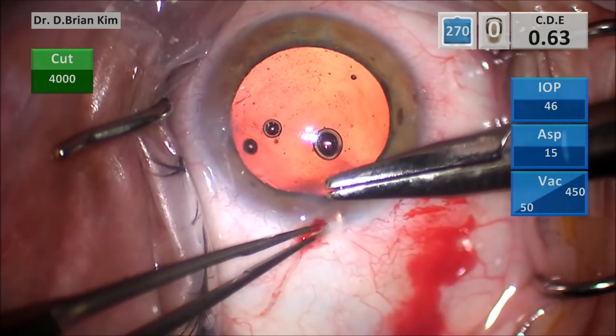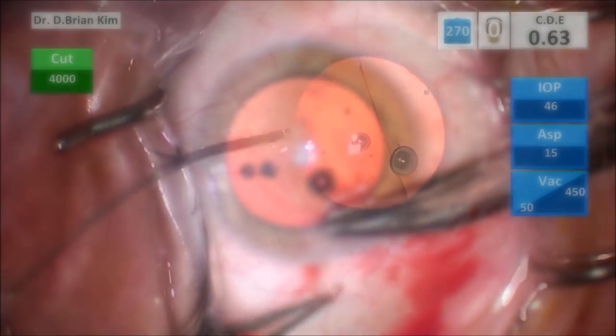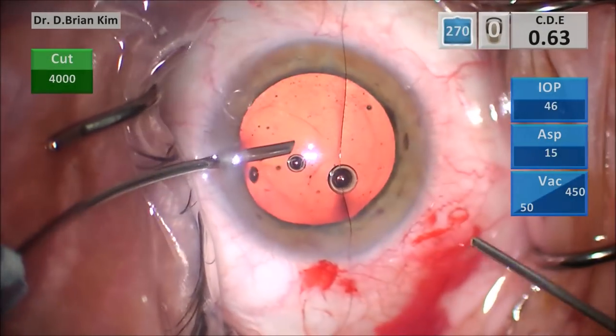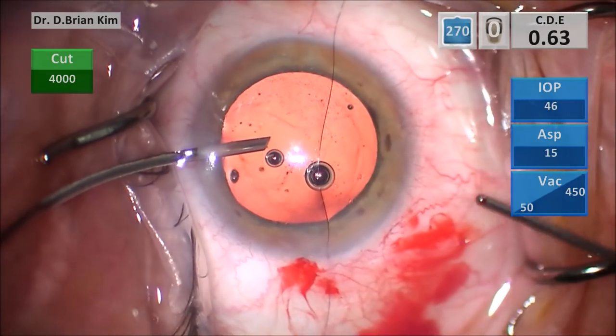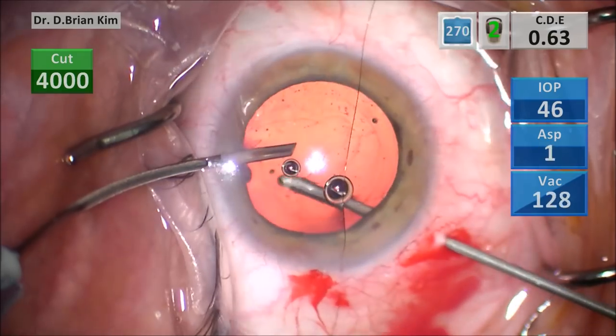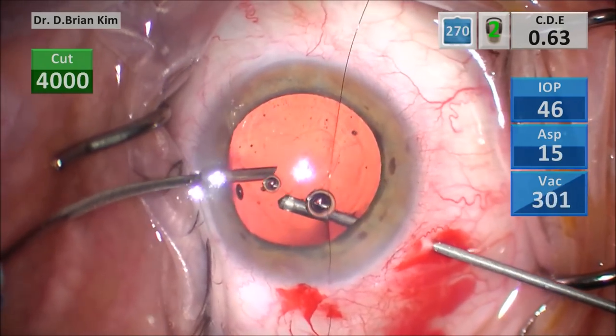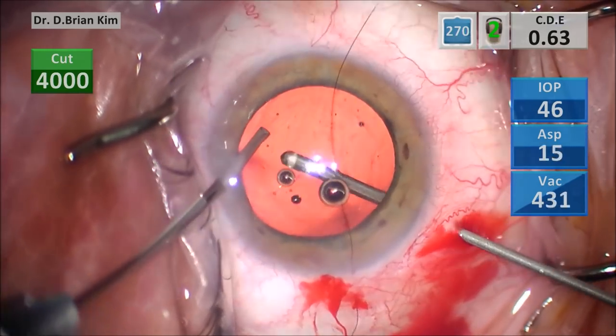Especially in unplanned situations, the trocars are really meant for self-sealing incisions, and you have to apply a lot of pressure on the eye to create that incision. I didn't feel comfortable doing that because pushing on the eye can just invite more vitreous. This just felt like it would be more gentle.